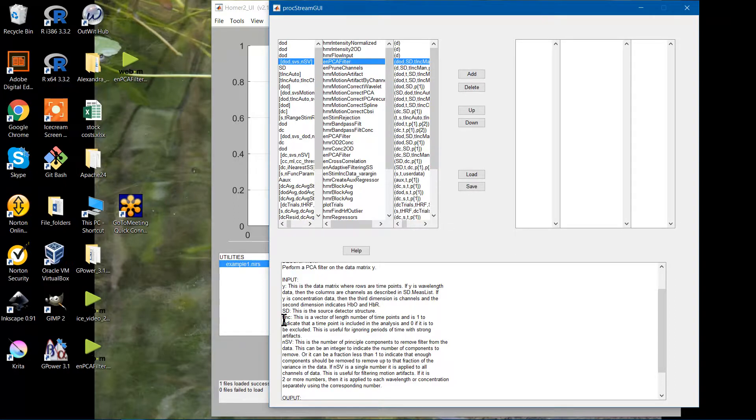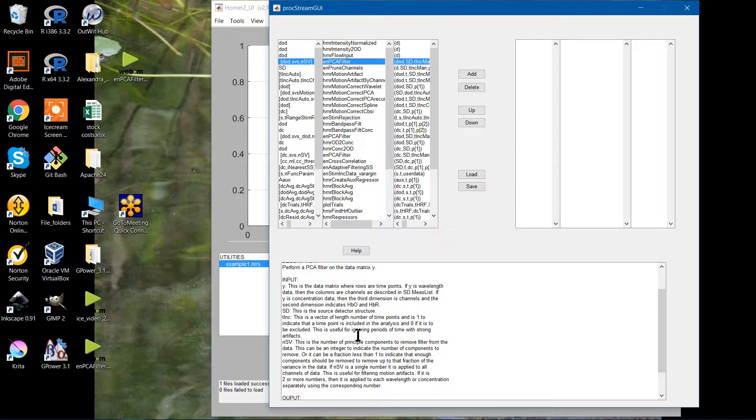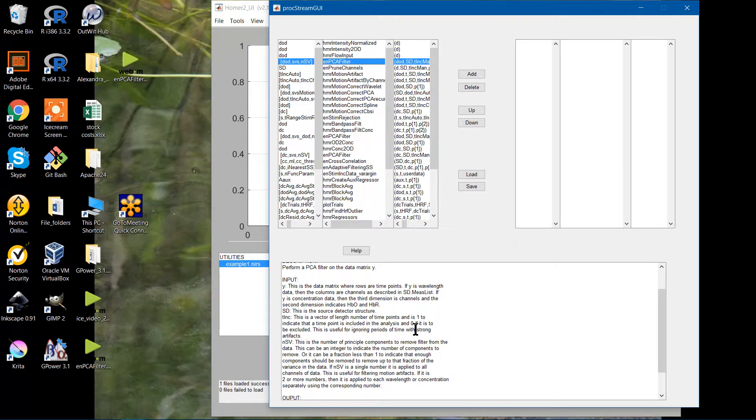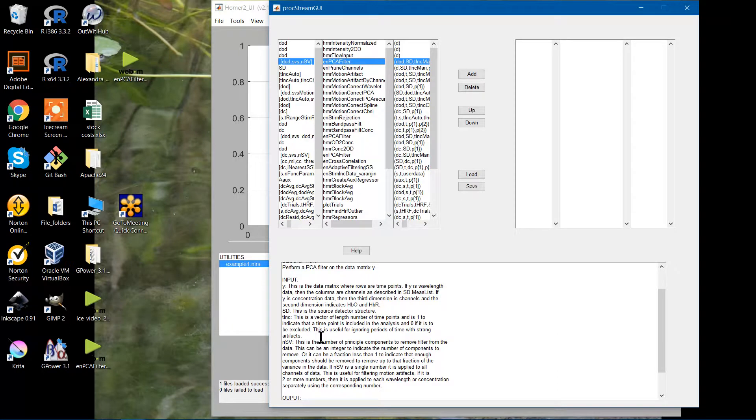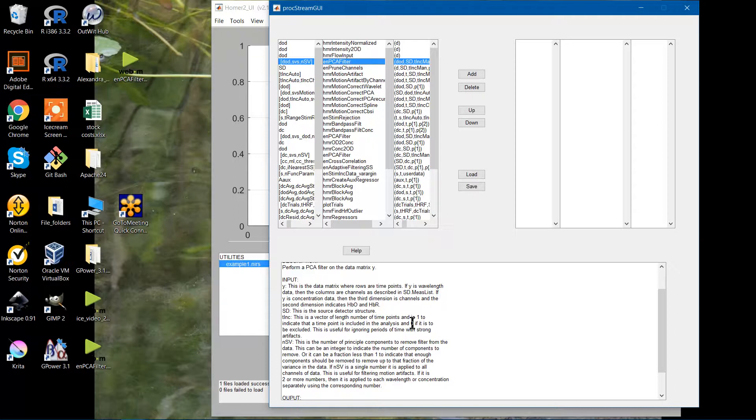Below that, you have the TInc, which is the time included. It's an array or vector that basically has all your time points, and it's going to be binary. So if you have a 1, that time point will be included. If it's a 0, it will not be included. It mentions here it's useful for ignoring periods of time with strong artifacts. You could also use it if you have too long of a baseline or a long rest period between stimuli. If you don't want to include all of that in your data, you can weed that out by manually editing these zeros in.